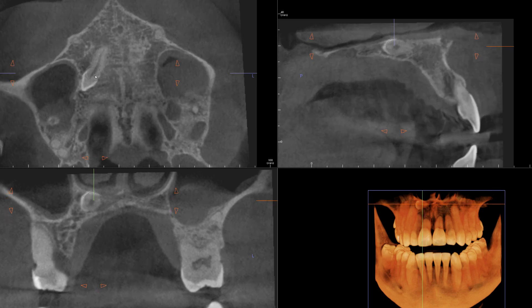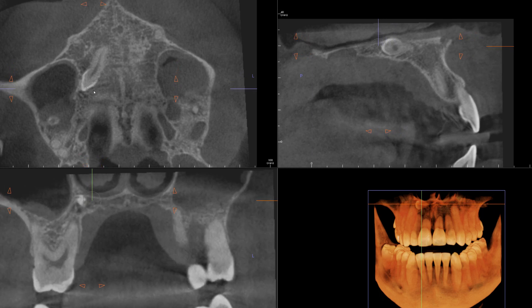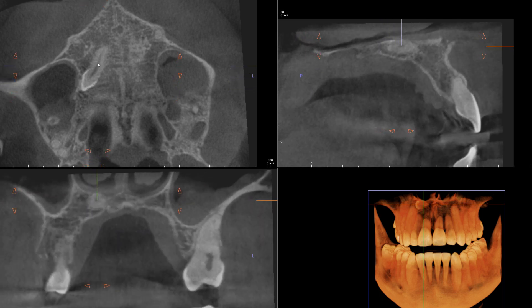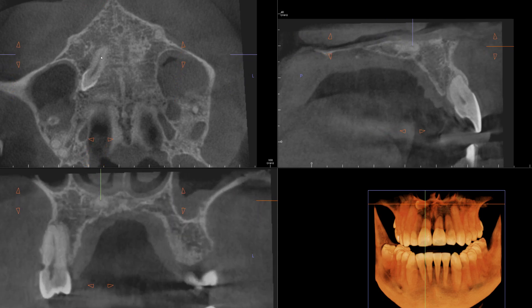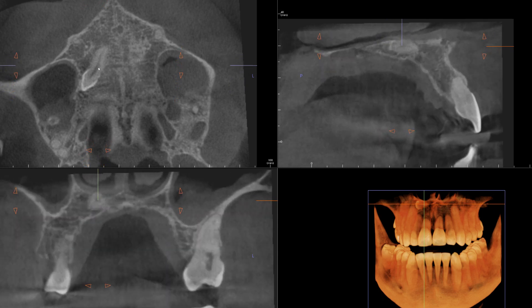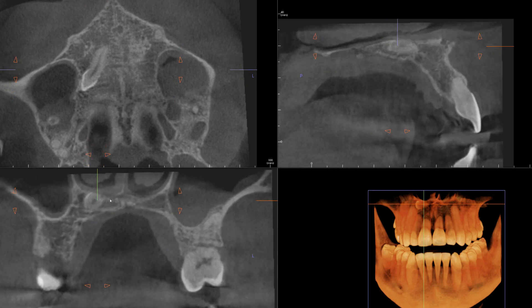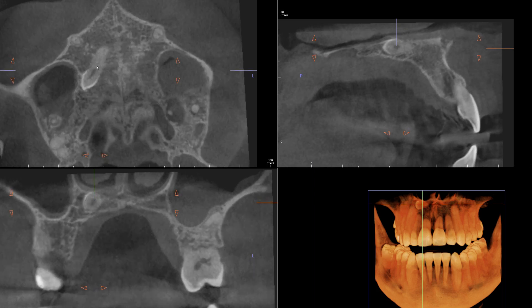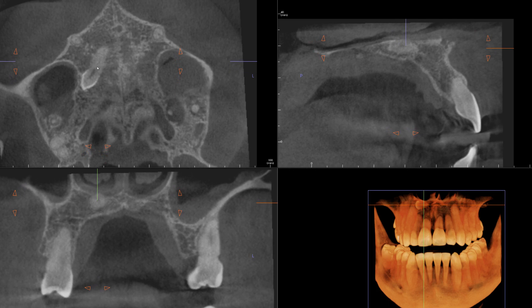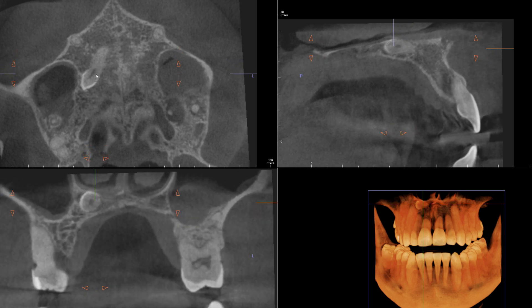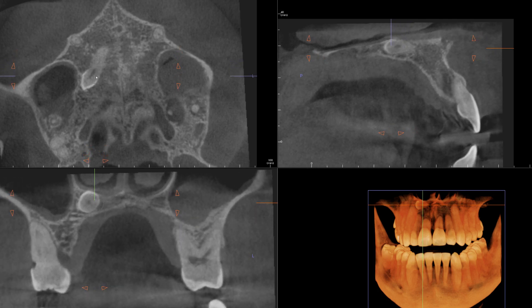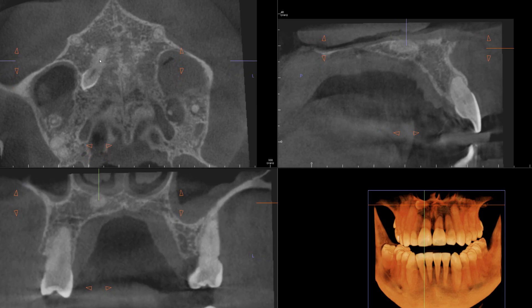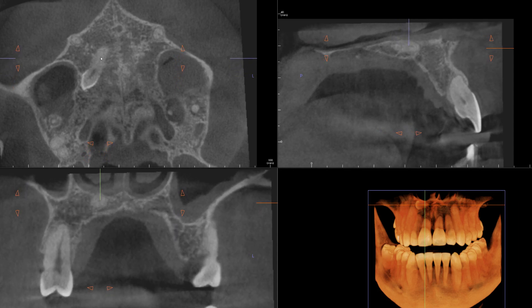Now as we scroll through the coronal views, you can see its relationship to the floor of the nasal cavity. Not only is the floor markedly thinned, but there's a possible communication with the tooth and the floor of the nasal cavity.